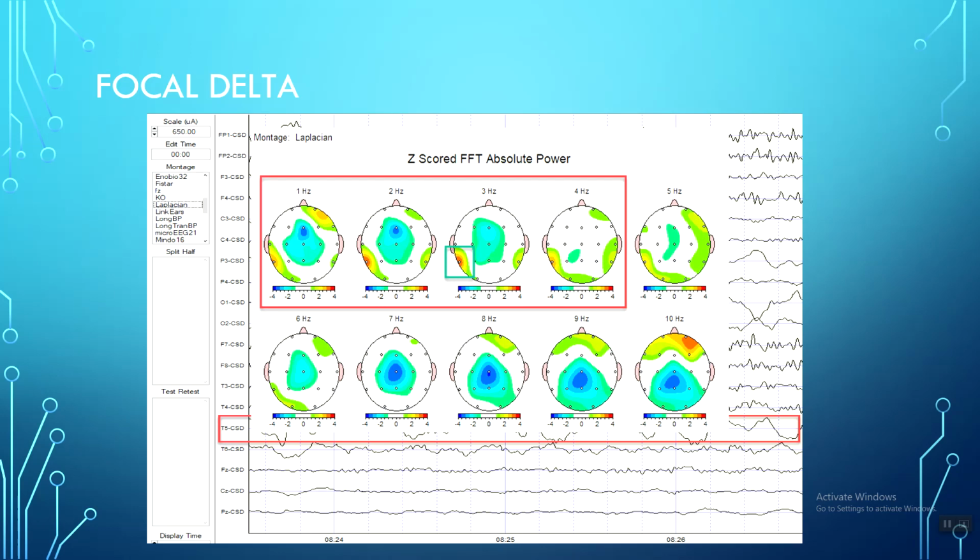It's another conversation for another time. But you're right. The spatial resolution of EEG is more limited than the temporal resolution of EEG, and there are ways to find where things are located spatially. It's a little bit more advanced. We use independent component analysis to do that, but it's something that we'll certainly expose people to this week.